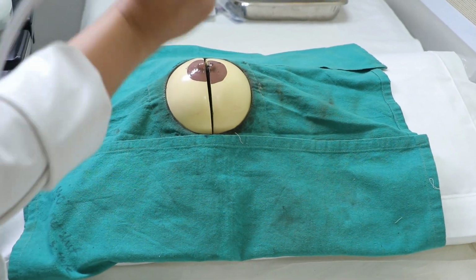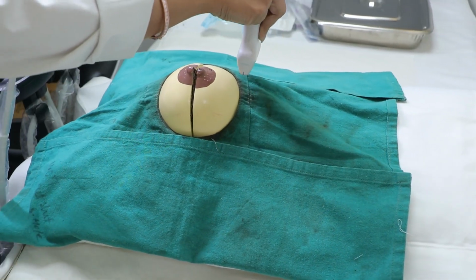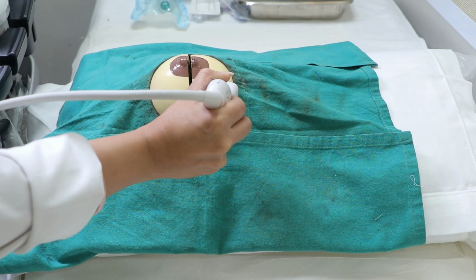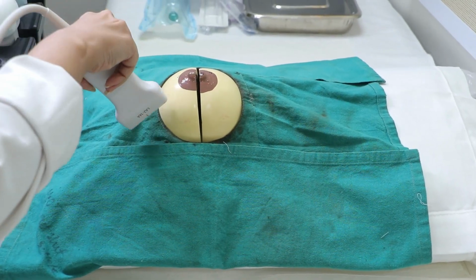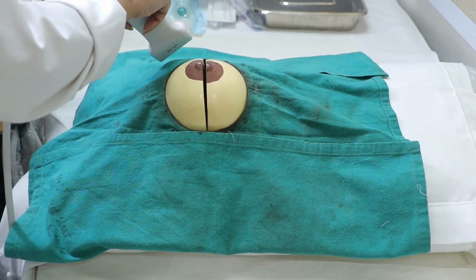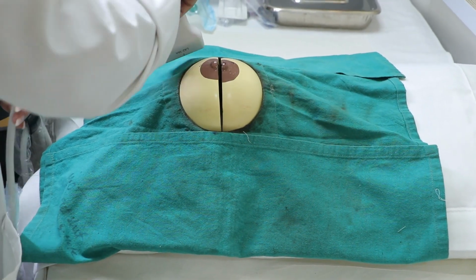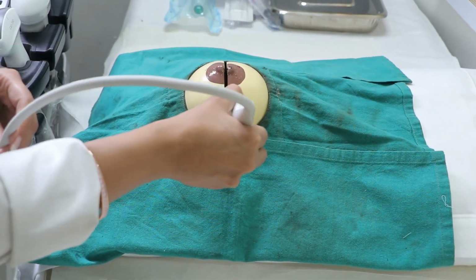Then the other probe movement that you have to see is the transverse movement. That means right to left, left to right. This is the transverse position. The third position is longitudinal. Now what is the difference between radial and longitudinal? See, longitudinal I am doing like this on the breast. Radial I am doing oblique. So longitudinal position. Radial is the one which we do clockwise.